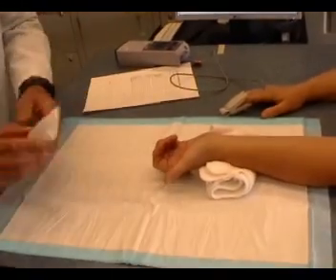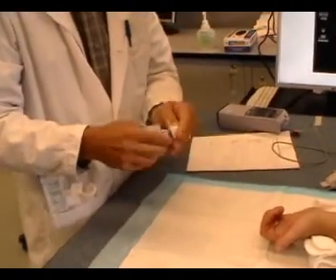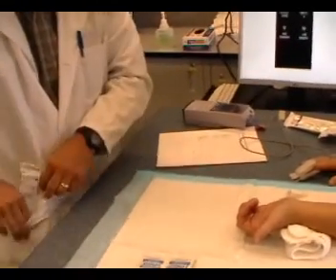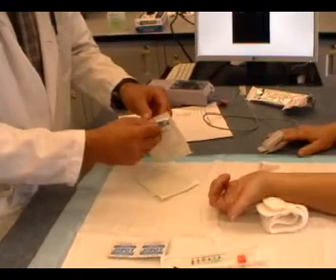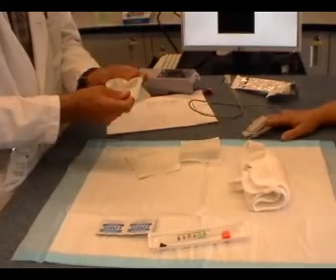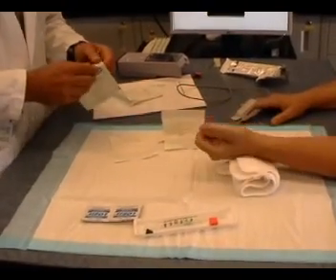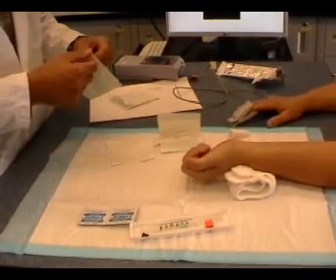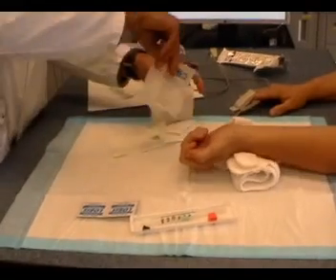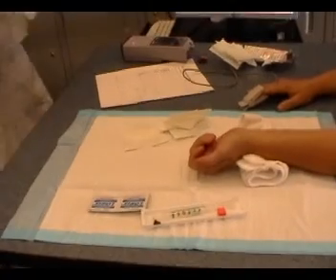I've got my stuff here, and I know it's a little intimidating seeing that needle. I don't like needles at all. Nobody does. I'm hoping this will give us the results we need so that we can get you out of here. This procedure does hurt a little bit, and it's okay for you to yell and scream at me, but I don't want you to pull away. I really want you to just hold tight, and I'll be holding your hand. I'm just going to put on some gloves here — keep everything nice and clean for you.